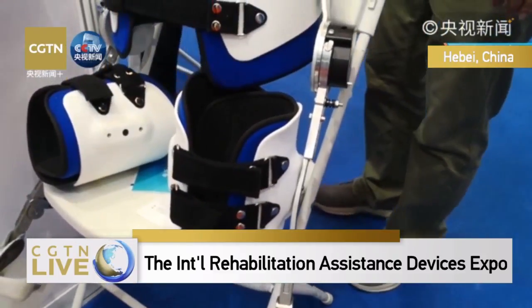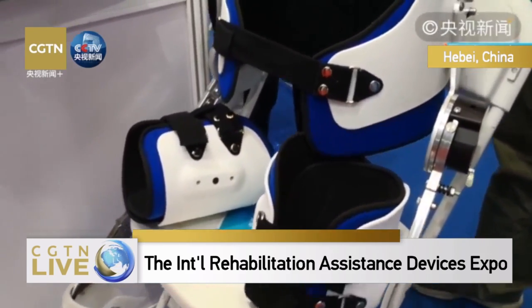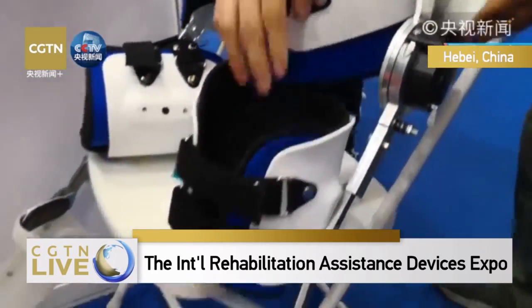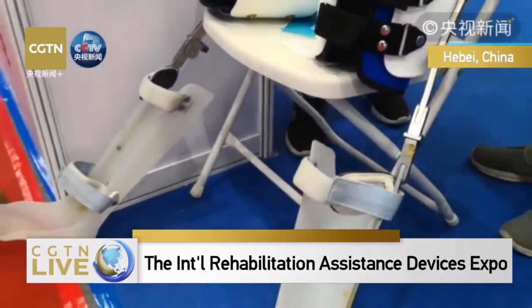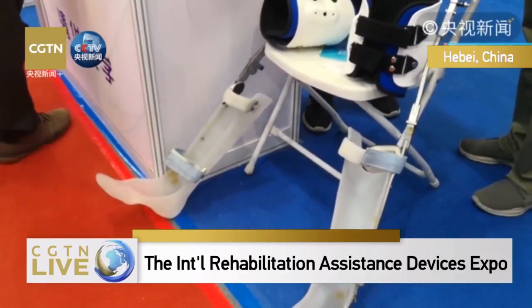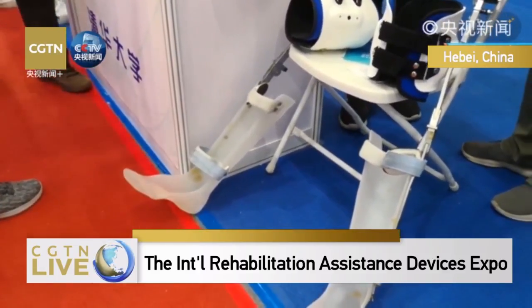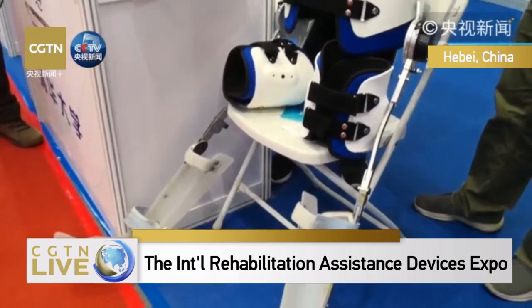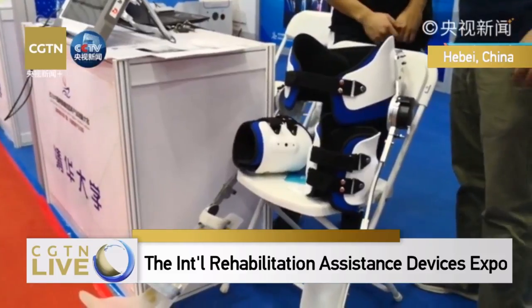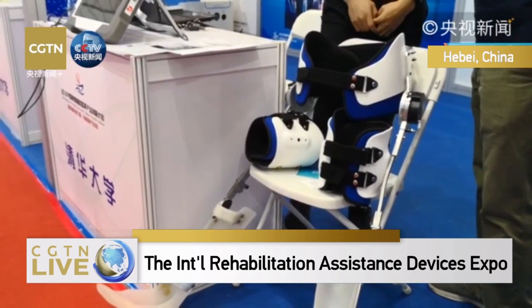The exoskeleton with exterior motors will cost about 1 million, but this one is much cheaper and it can also work better. This is an experimental photo on a patient in a clinical trial. It can increase the walking speed of the patient by 50%, but you will still need a walking stick.